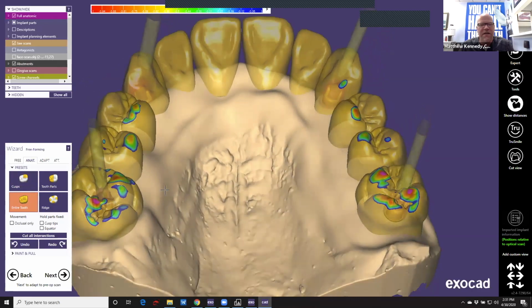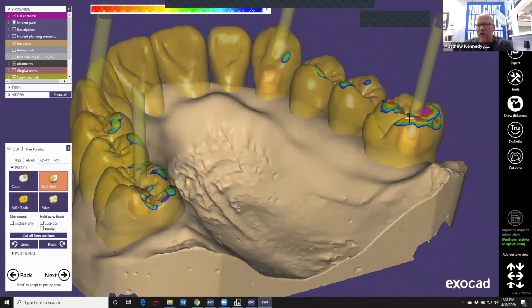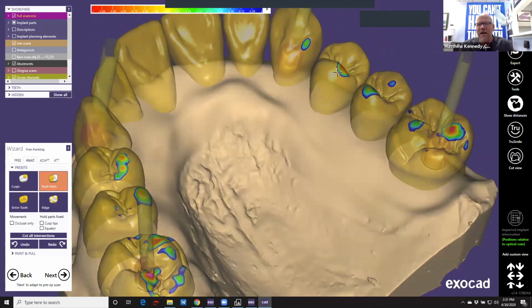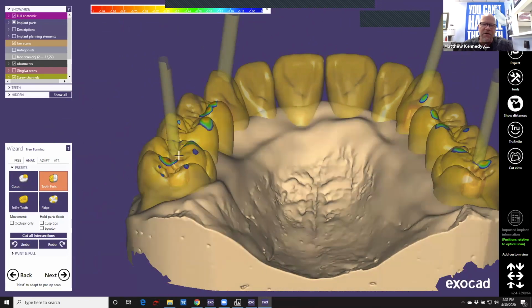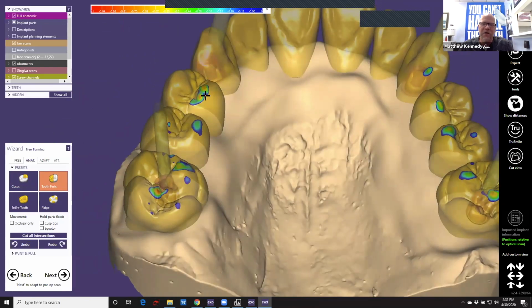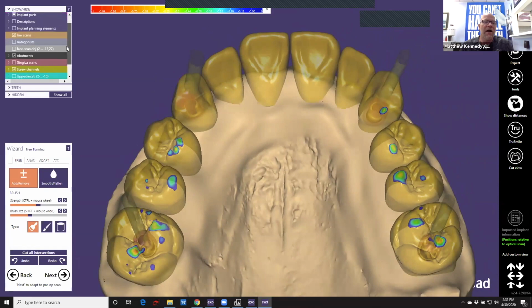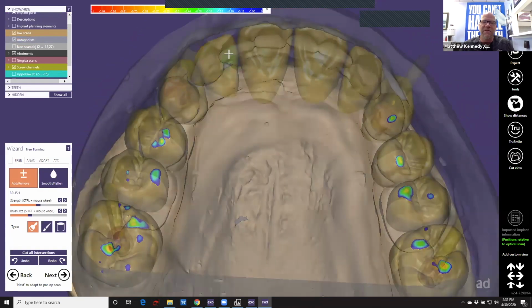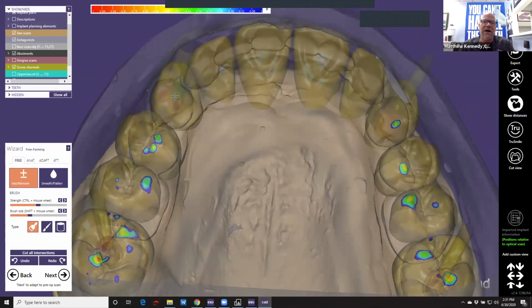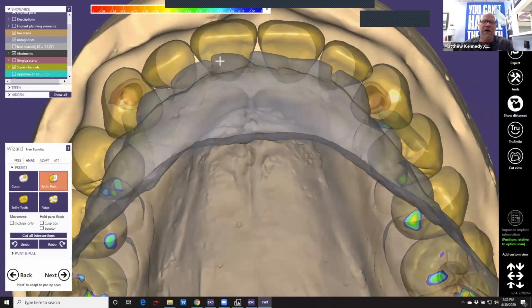And I can tell you, there's nothing like seeing a patient see their face, and when you do the restoration on it and they see it, it's amazing. They get it. You're not handing them a stack of papers that says, oh, you need $30,000 worth of work. Take these home to your spouse. Now, with exocad being able to send the files digitally, it allows the patients to have 3D images that they can show their spouse what they're going to look like. And that has been a huge advantage.